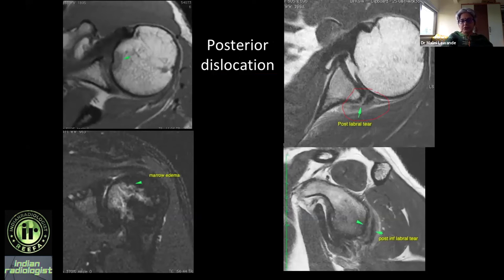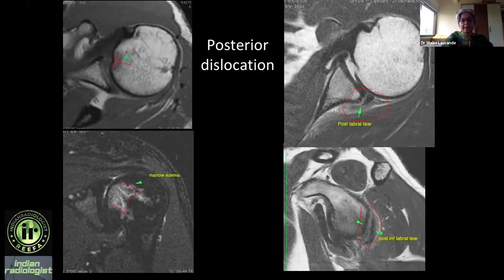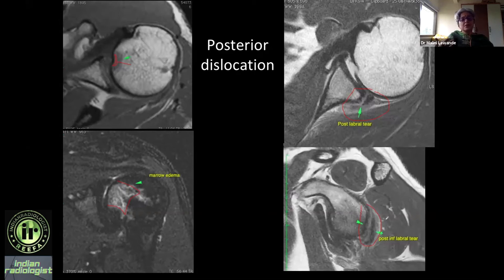A posterior inferior quadrant labral tear is very clearly seen. But what else is happening? There is a small depression at the anterior superior humeral head with marrow edema — that means there has been a posterior dislocation. This is a subtle reverse Hill-Sachs lesion. With a posterior labral tear, patients may say they feel the humeral head moving, whereas posterior dislocation may not present that way.